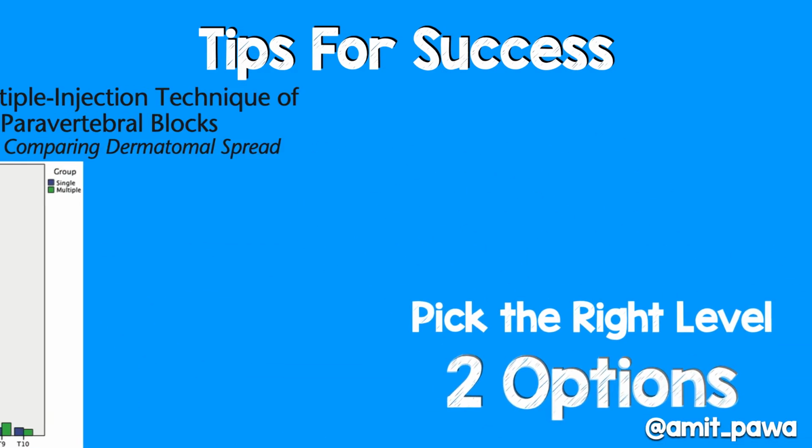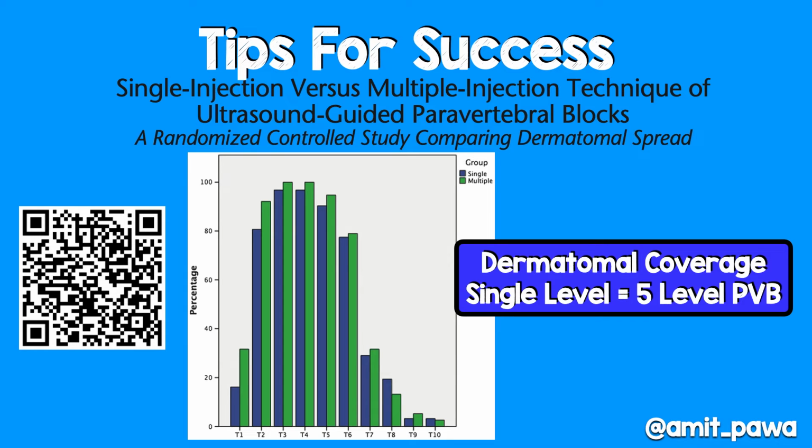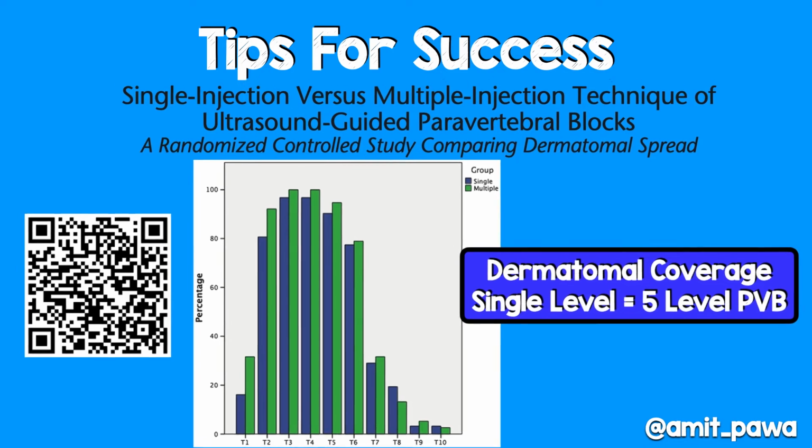And why is that? Well, there are some historical papers that show the benefit, but there's a more recent paper looking at ultrasound guided paravertebral blocks, and it showed that the dermatomal coverage you get from a single level is the same as the dermatomal level coverage you get from a 5-level block. So why do 5 needle sticks when you can achieve the same analgesic effect with a single level? And that's what I do.